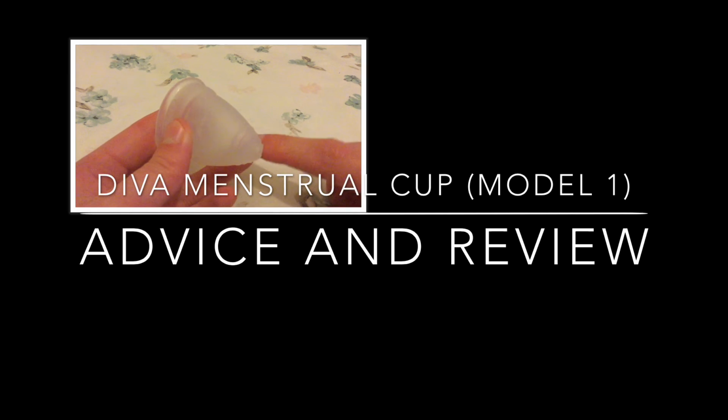What I do, and this is recommended when you insert the cup, is double check that the cup has unfolded right. If it isn't, then it is not going to catch all of the stuff that it needs to catch, and you need to take the cup out and start again. The way that I find is best and easiest to check if it's fully unfolded is I take a finger and run it around the bottom of the cup.